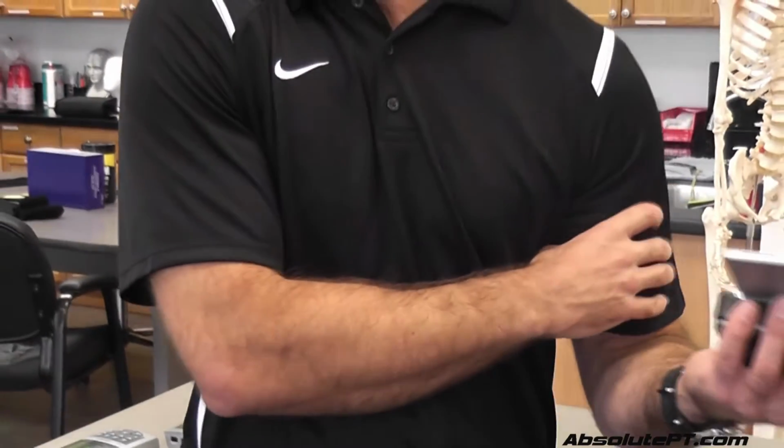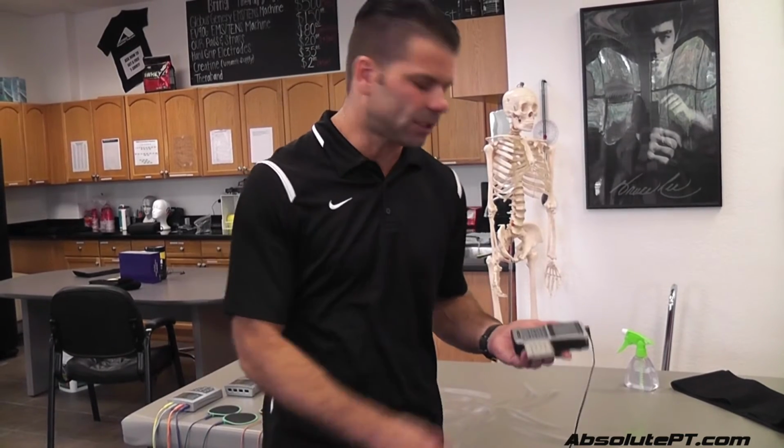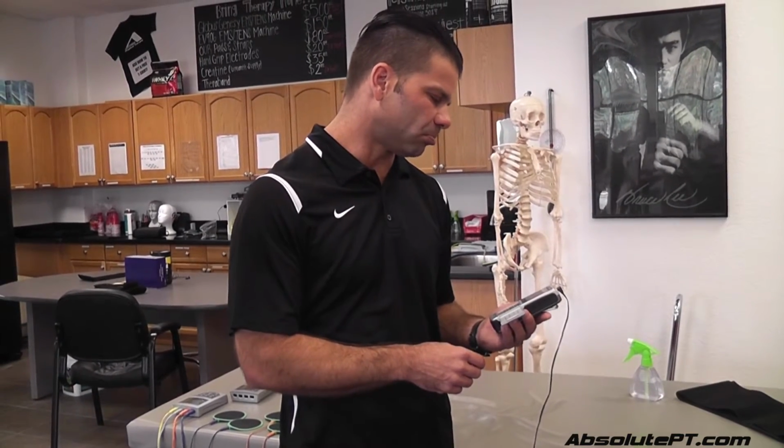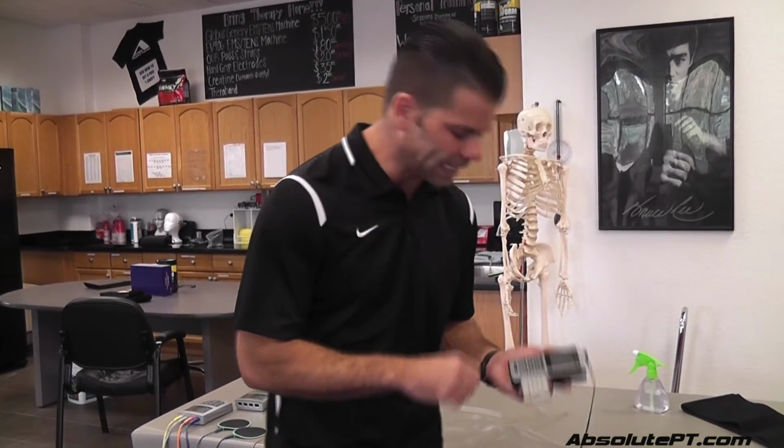Calves are, like if I was doing this on my arms, it would be probably more than I could take. If I could do it on my abs, a little less than I can take now, but I can take a lot. On my calves, it's definitely not overwhelming. I would want more stim, but even if I use the Globus on my calves, it pushes me up on my toes, and I don't like to stim calves. The only reason I do it right now is it's easy and handy.